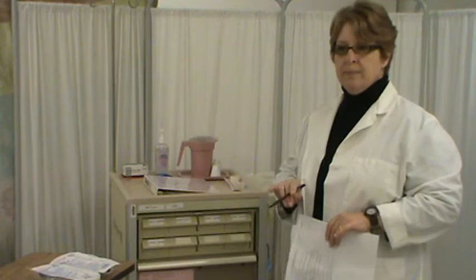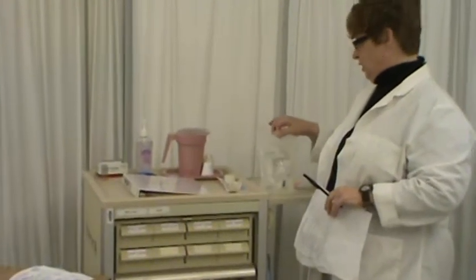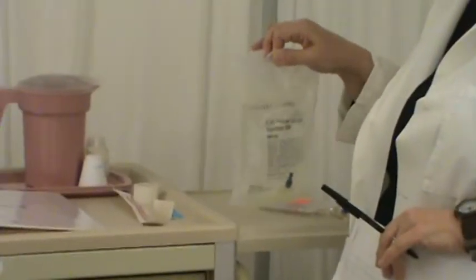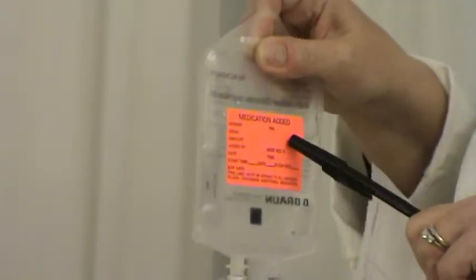So the main skills that you need to be able to demonstrate in this are that you can correctly choose your primary solution, correctly choose your piggyback solution, and then you'll choose the proper tubing. Your bag probably will look something like this, or maybe a liter size. That's your primary. Your secondary will have a label on this. You'll have to read that label and choose the correct medication.